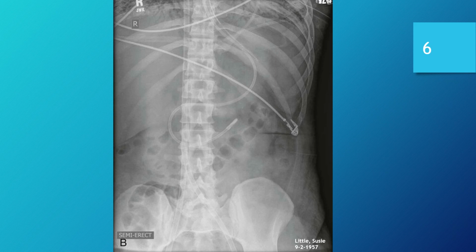But first and foremost, of course, is all required anatomy for this image present. I'm going to say that we make our little reference marks there, here, and here.